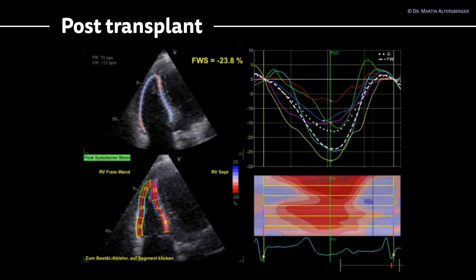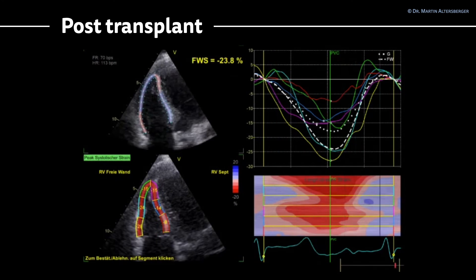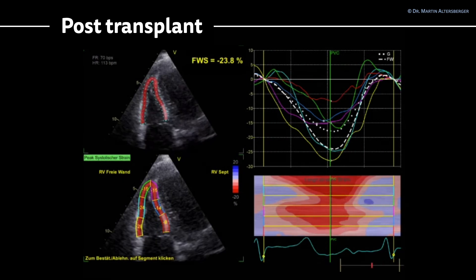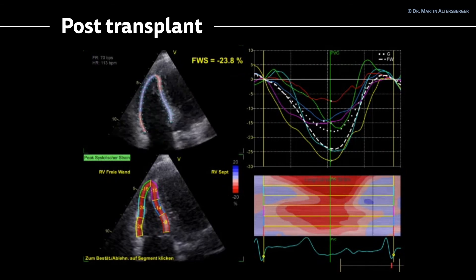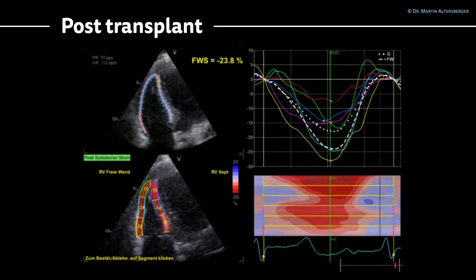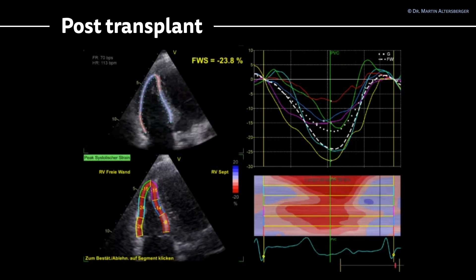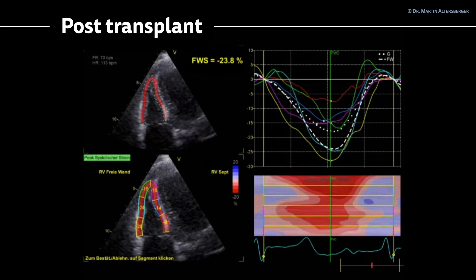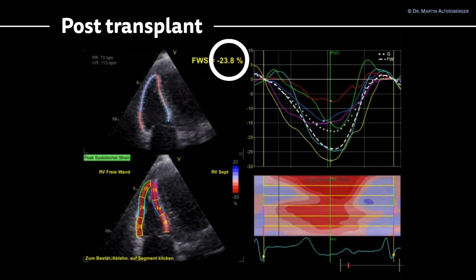Regarding right ventricular strain in the transplanted patient — it is very important to also assess the right ventricle, as it provides valuable information on how the patient is doing and the overall prognosis. In this specific case, the free wall strain of minus 23.8 is absolutely normal.